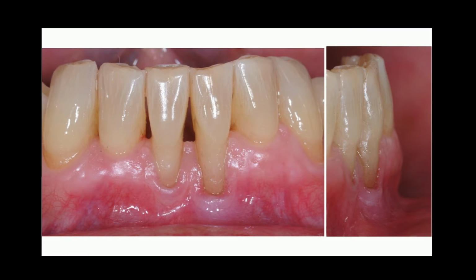If you look at this case, what is the patient's complaint and what is my goal? The patient's complaint was, I'm not able to keep this area clean. And my goal in treating this area could be for sure not to obtain complete root coverage, because complete root coverage in this RT2, 3 class, it's impossible because I have the exposure of the interproximal cementoenamel junction. I have the lack of interproximal soft tissue. So achieving 100% complete root coverage is not possible.